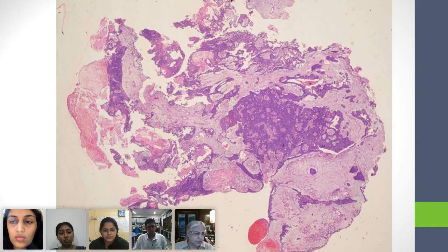So now, do you think that you would automatically see there is a hole between, with a very thin bone in between. It's epithelialized and there is something fleshy popping out. Are you likely to see normal tissue?